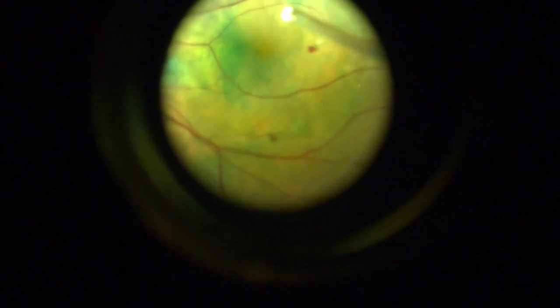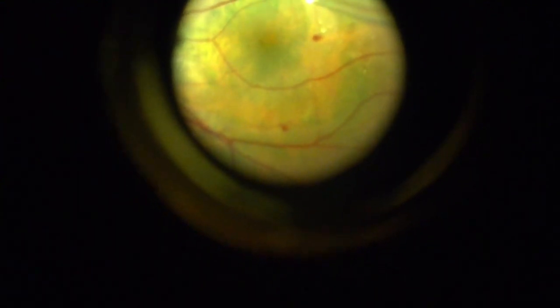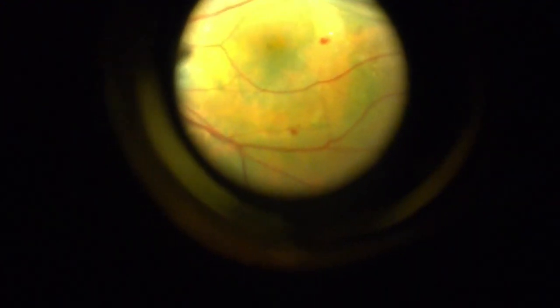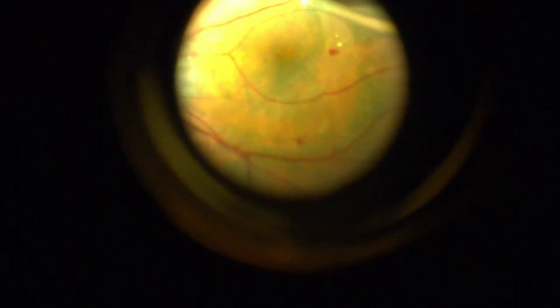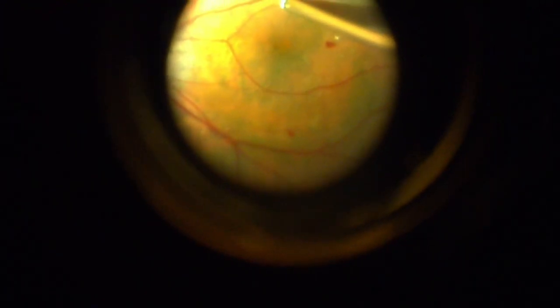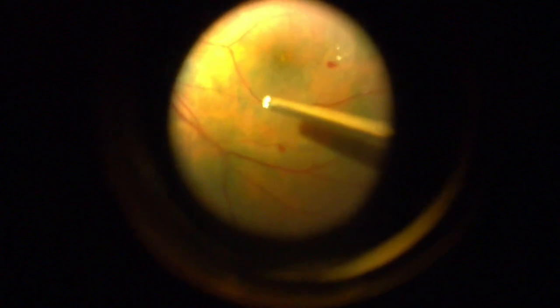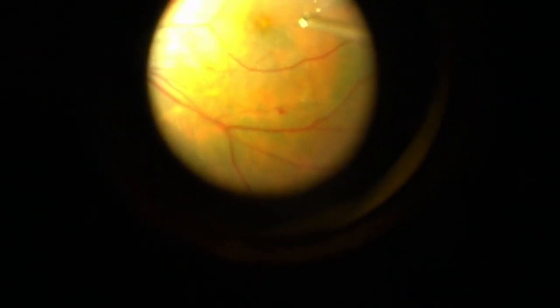And as we're pulling out the dye, you can see where it's at and where it's not at because we restained that internal limiting membrane. And what I found is that if I go down real close to the retina and hit the aspirator, I can quite oftentimes engage the internal limiting membrane just like this. And so that peels the central macula pretty well. You see all the green is gone now, the membrane around the center.